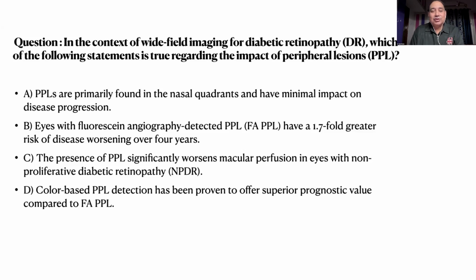Great. So I think the majority of you have understood correctly that FA PPL seems to be more important than the color fundus PPL, though we should not underestimate the value of color fundus also, because it does give us certain information which I had shared initially.